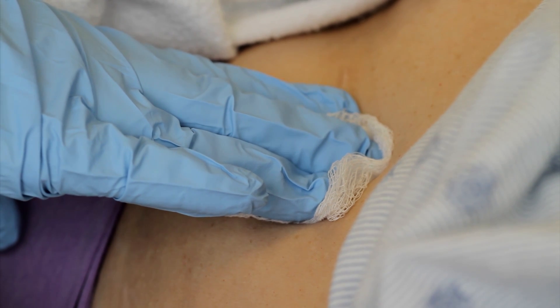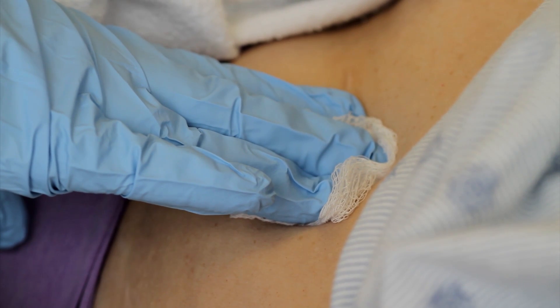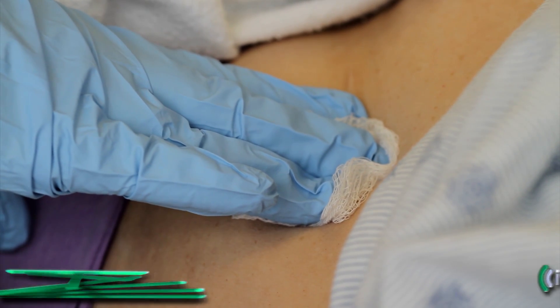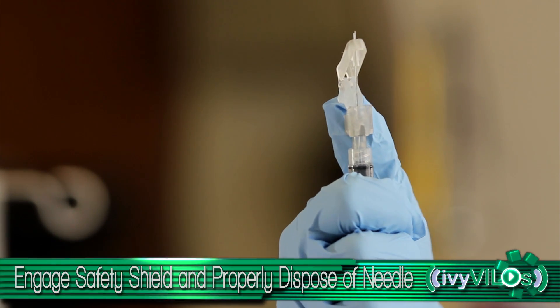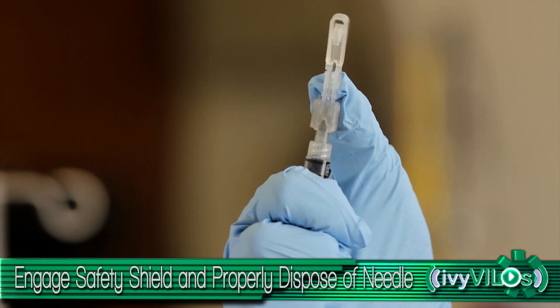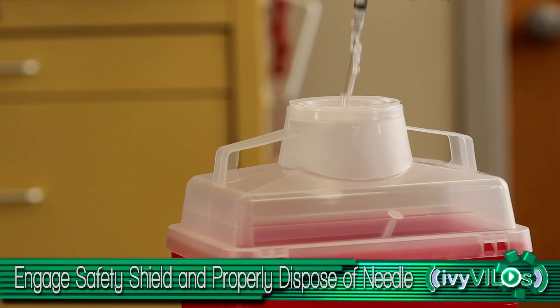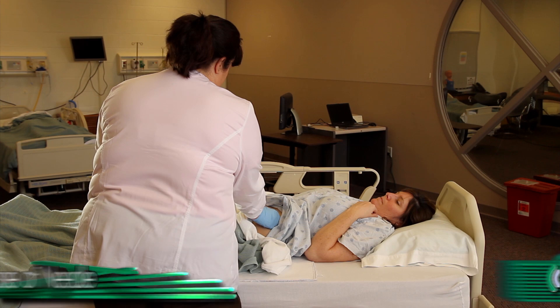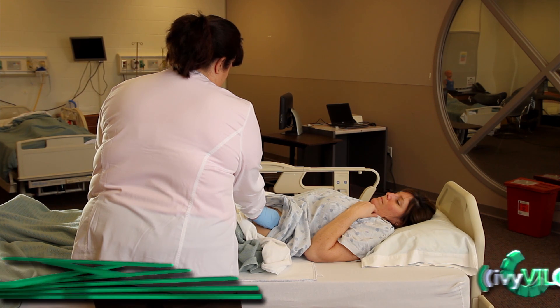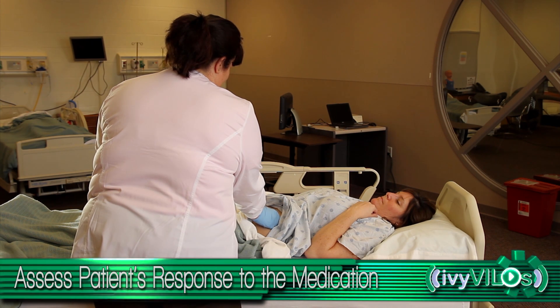Do not recap the used needle. Engage the safety shield or needle guard. Discard needle and syringe into the appropriate receptacle. Assess the patient's response to medication.